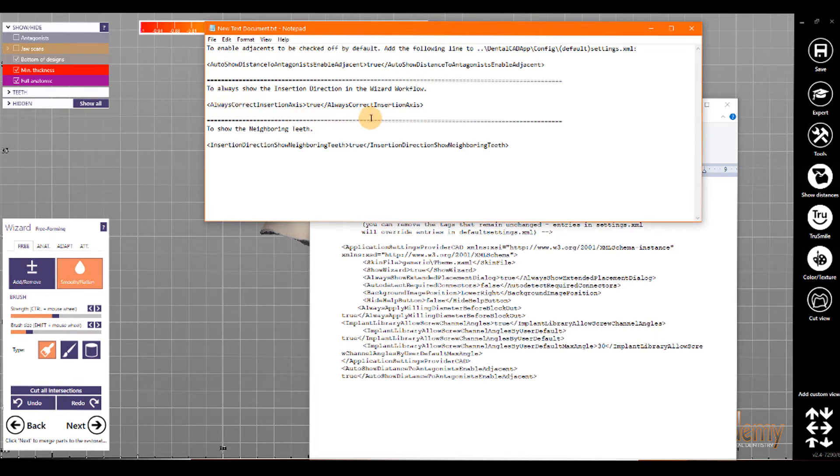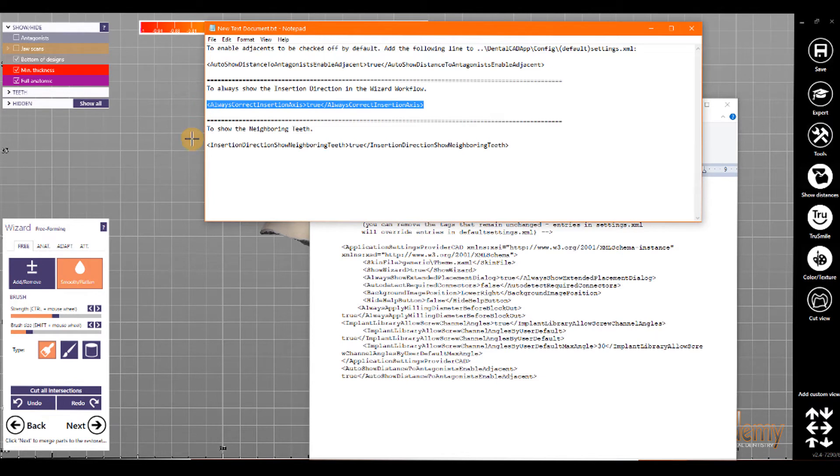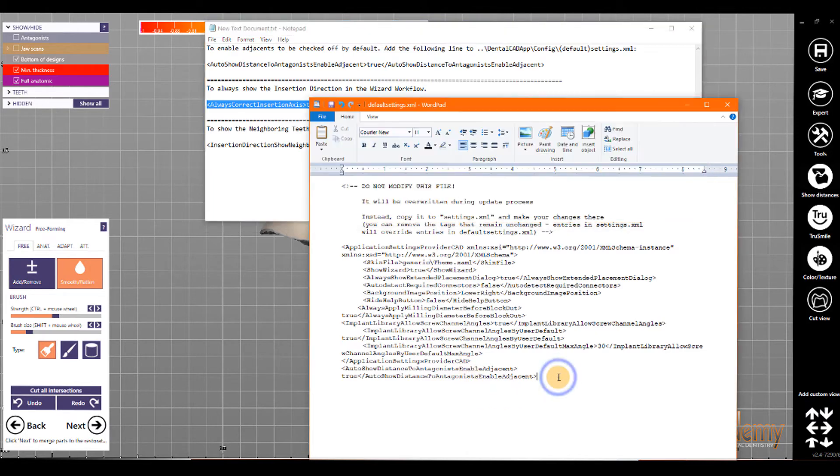To always show the insertion direction in the wizard workflow, we're going to use the XML tag, always correct insertion axis, and we're going to make the value true. So, I'm going to copy and paste that.